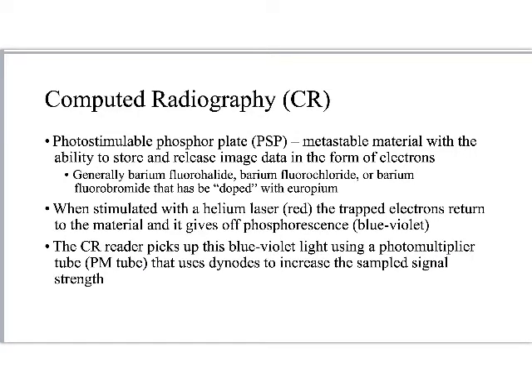So now that we've reviewed an overview of how digitization occurs and what role bit depth plays in that, as well as the role of contrast in appreciating the images that we've made, let's get down to the weeds with some computed radiography. We're going to go back to the chapter and really think pretty closely about it. I'm kind of going out of order with the chapter pages, but we're on page 596 in the textbook.